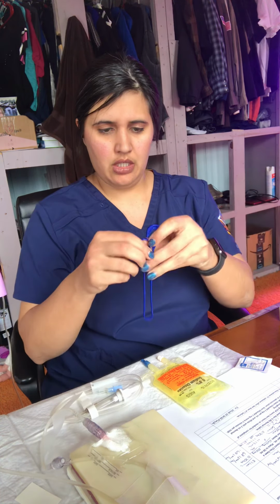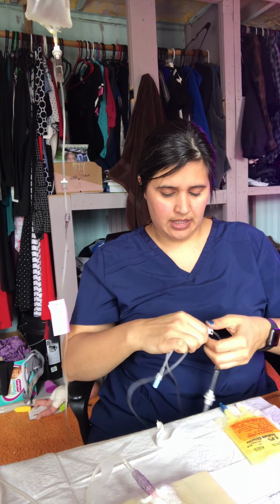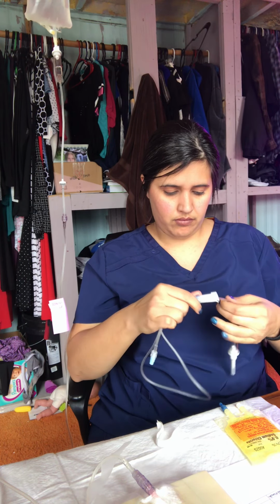I have this hook, which I will hang the regular IV bag on. So let's pull it there. You can sort of see it now, the regular IV bag on. I will separate this tubing. My trash bag over there. I'm going to close this clamp. Okay.